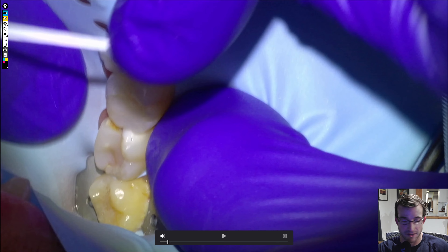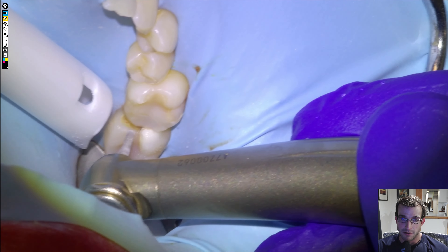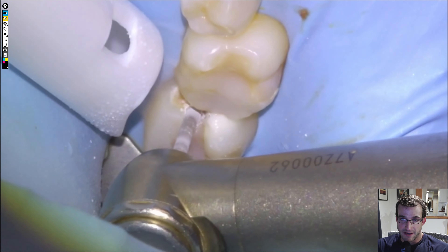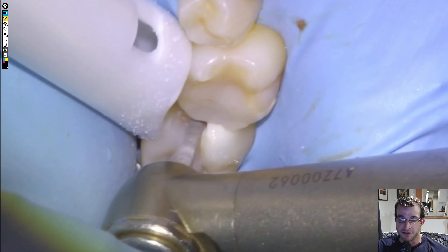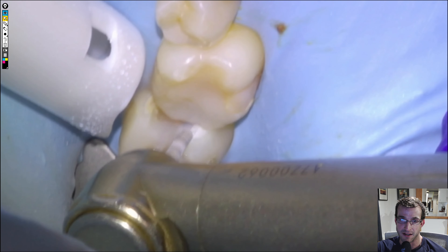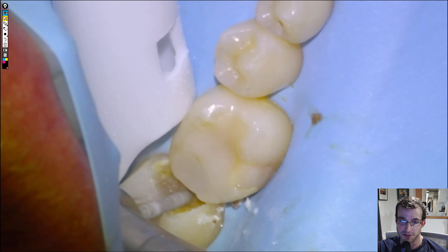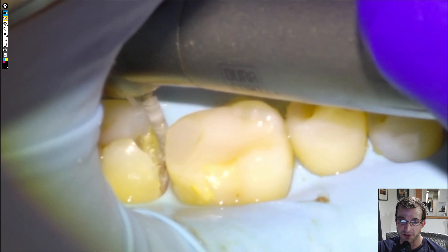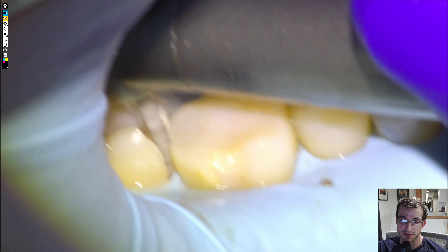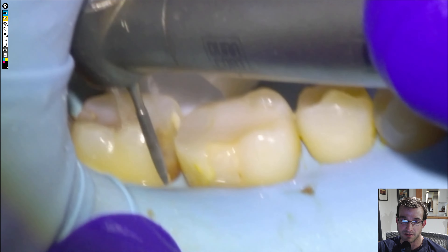Clamping the wisdom tooth, we would have given a block of articaine and then a long buccal. We'll get started with a KS-1 on a high speed, just removing the bulk of the decay and the old composite material. It's going to be a large box and we're going to tell the patient that there's a good chance we might get close to the nerve, so a root canal might be needed.